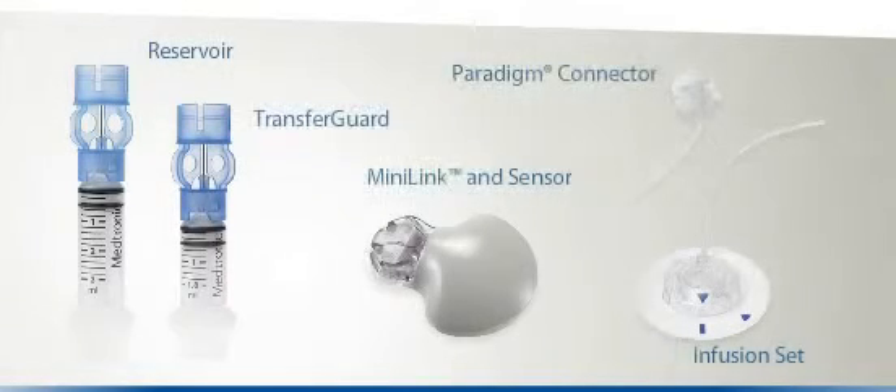Before we go on, here are some of the items you will need: a Paradigm Reservoir integrated with a transfer guard, a Paradigm Infusion Set which connects the Paradigm Veo to your body, and finally the Minilink and Sensor, needed if you are using the Paradigm Veo's continuous glucose monitoring functionality.